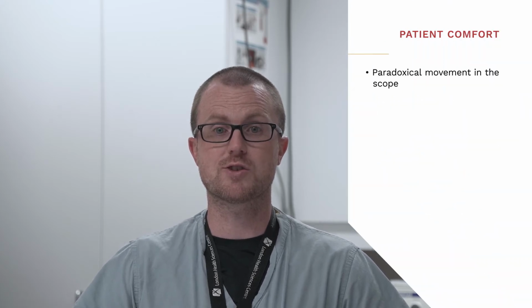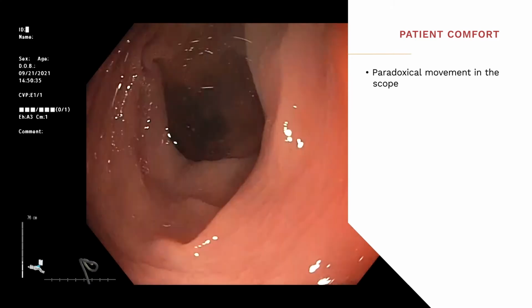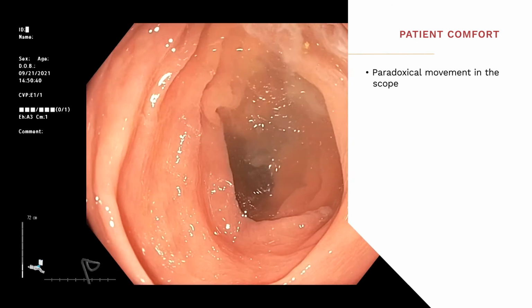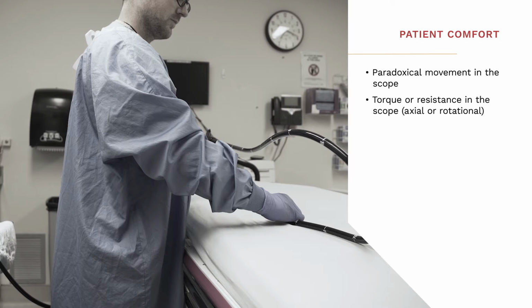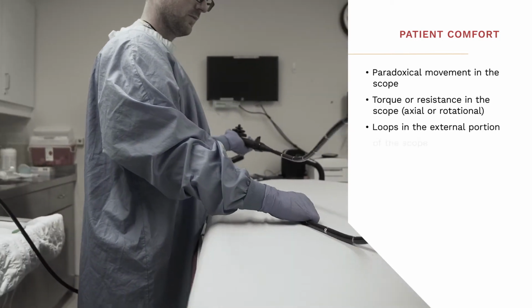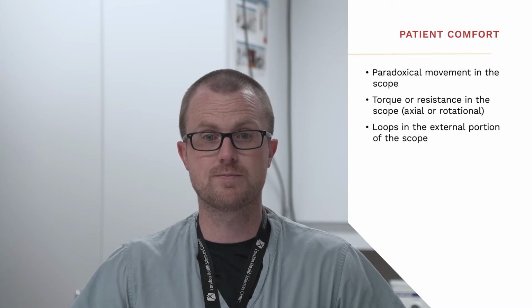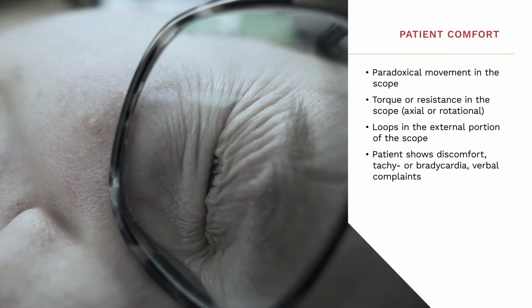There are a number of early and late cues to the endoscopist that you may be at risk of causing pain to your patient. Visual cues include paradoxical movement in the scope, where despite advancing the scope, you either remain in the same location or fall further back on the screen. This is suggestive of loop formation. This can also be visualized with the ScopeGuide. Later cues include a feeling of torque or resistance in the scope, either axial or rotational, or even loops in the external portion of the scope after a prolonged struggle to negotiate a turn in the colon. The final cues come from the patient, including tachycardia or bradycardia, or verbal complaints of pain.